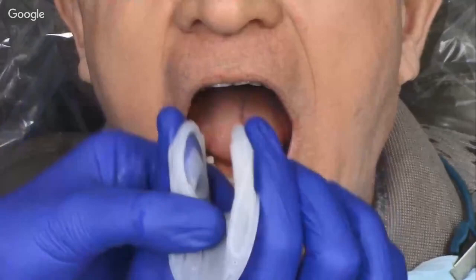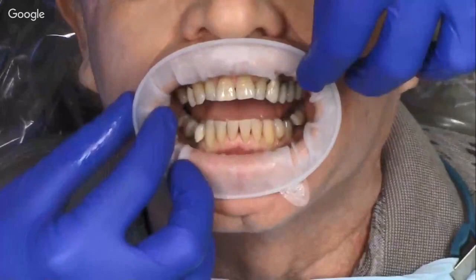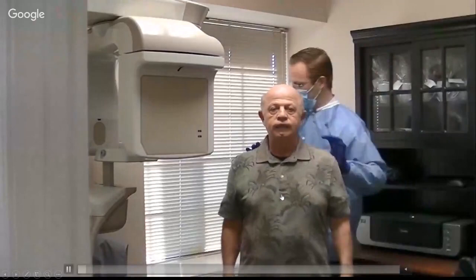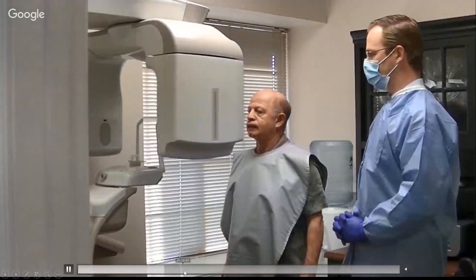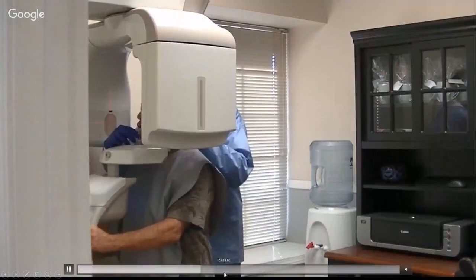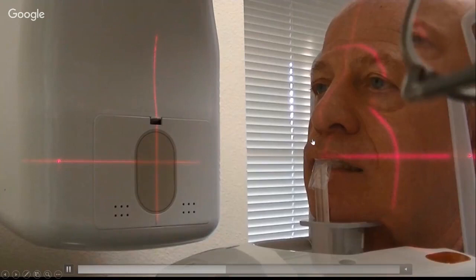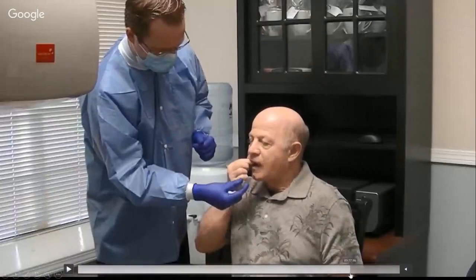The last step shows using the Obtura-Gate: slide it into the patient's mouth, squeeze from the sides and top and bottom, pop it in — making for very effective soft tissue separation. Then combine that with a couple of cotton rolls or have the patient bite down on the little bite stick. Back at the imaging area, set up in the cone beam scanner. Since I'm doing a maxillary implant for my father-in-law, I align the horizontal arrow right around the CEJs of the maxillary arch, with the midline in alignment with the patient's midline. The machine goes through its spinning function, and then I just have the patient spit out their cotton rolls. Done.